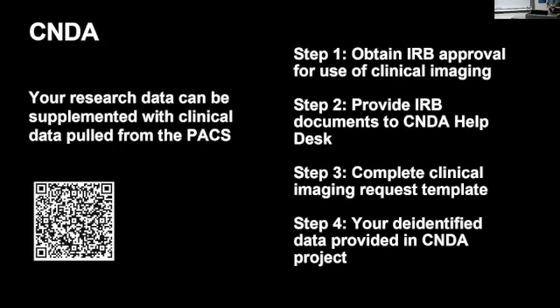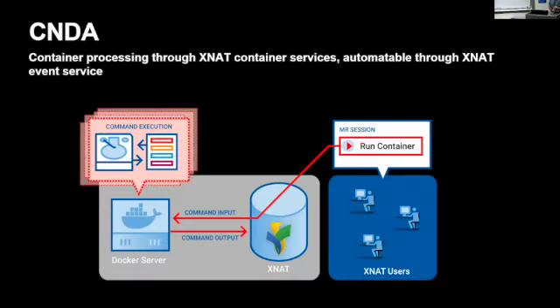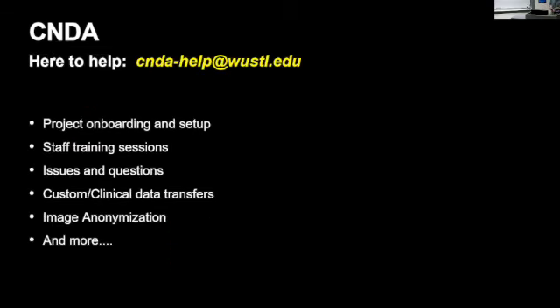And then CNDA can also reach out to the PACS, and you can pull clinical data into your project as well, that can supplement data that's collected under your project. And then CNDA itself implements container services, so it can do Docker-based container processing, which is fully automatable through the XNAT event service.